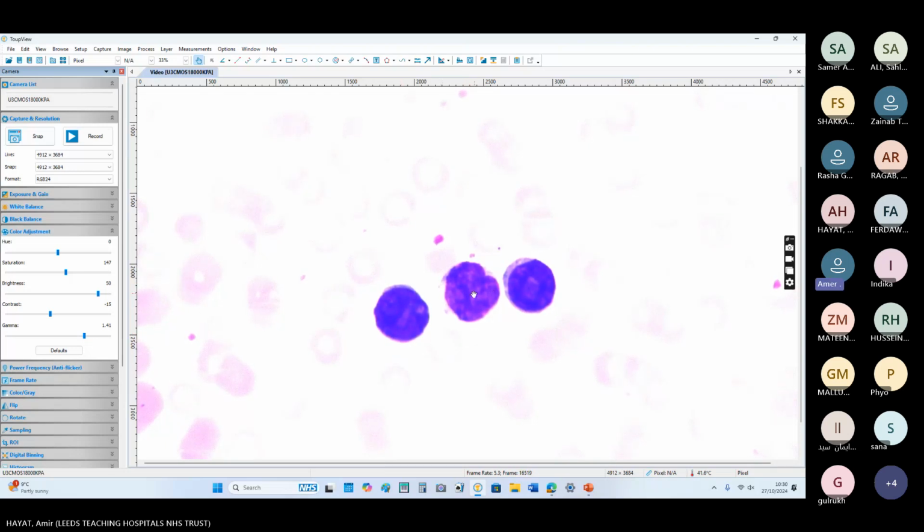It is only the morphology of this nuclear material, which is mature and has ups and downs in the nucleus. Like someone put water in the flour and then put a hand in the flour before making the bread. It has an appearance like that.